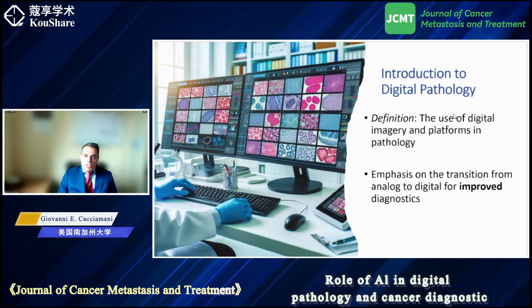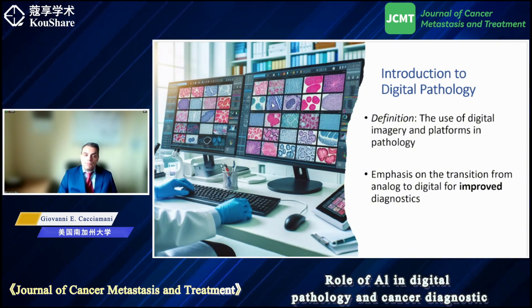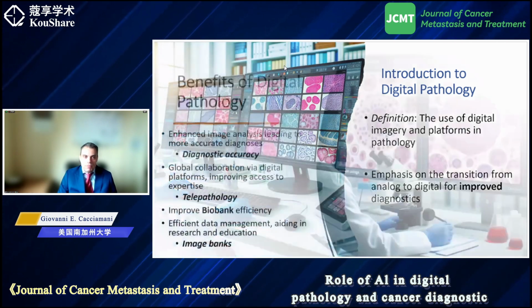But considering digital pathology, we should also consider what is included in the term digital pathology. First of all, the basic is the use of digital images and platforms to develop and analyze them through computers, and then how this can improve our diagnostic ability, which probably cannot just rely on having a bigger screen instead of the microscope to analyze tissue.